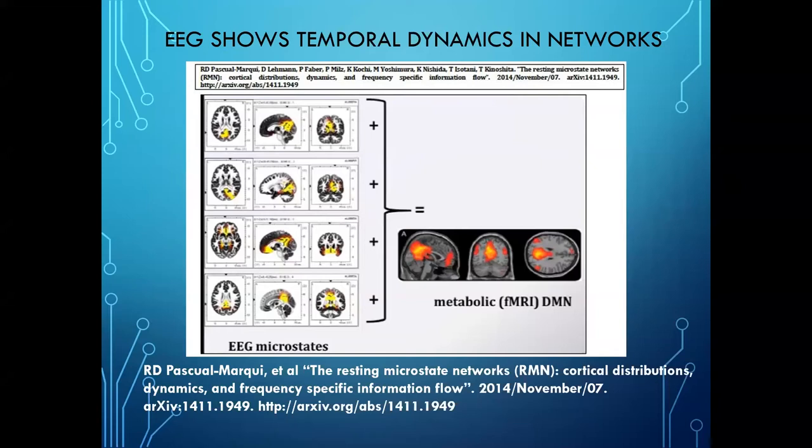Great. I don't want to just talk. On the right, you can see, and you're looking, there's nothing there. That's no good. So what you see, hopefully with my cursor going around it here, is the metabolically identified fMRI. Again, the bold signal, which is crudely equivalent to the slow cortical potential or infraslow content. You'll see a gigantic flare at PZ, the posterior cingulate. You see small ones in the temporal parietal junction area and a small one up front.